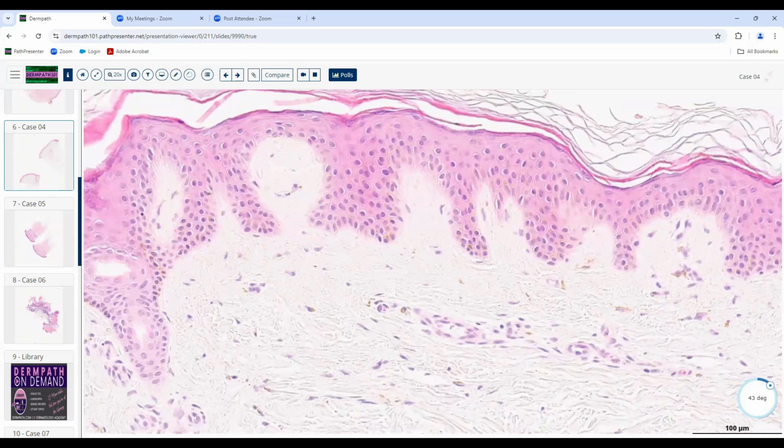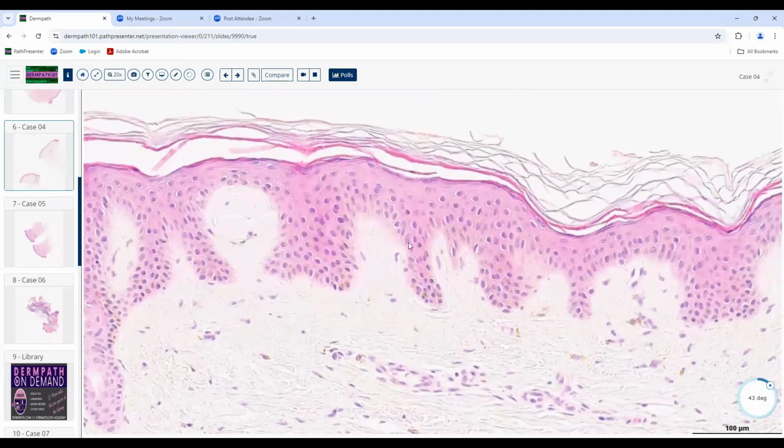Upper back is a common location. The pretibial area is another common location. And they might have thought it was, say, post-inflammatory pigmentary alteration, maybe burned out lichen planus, because there are all these melanophages here, so it probably looked brown, like it always does. And in this case, lo and behold, it turns out to be macular amyloidosis.